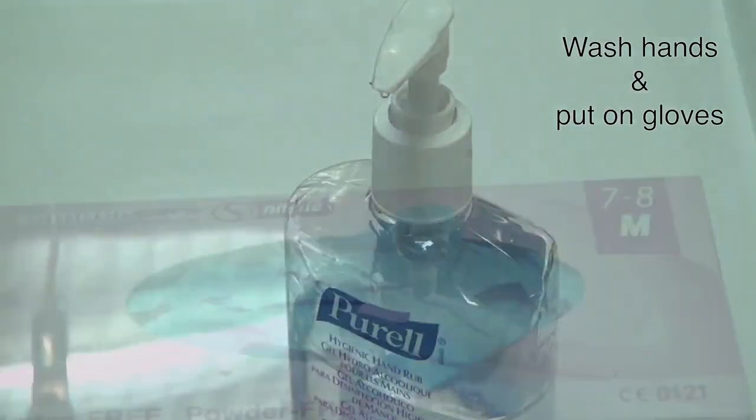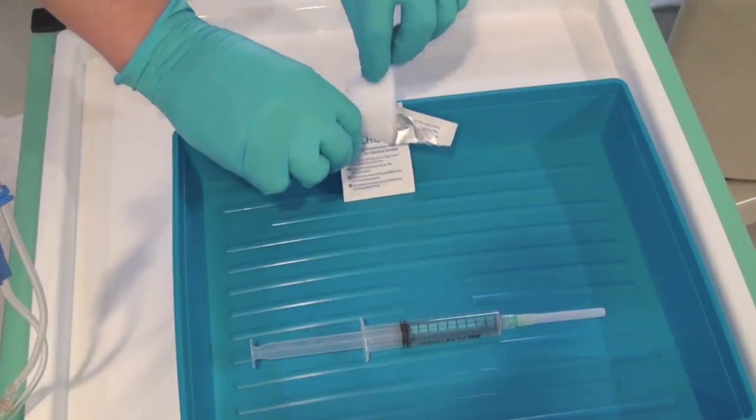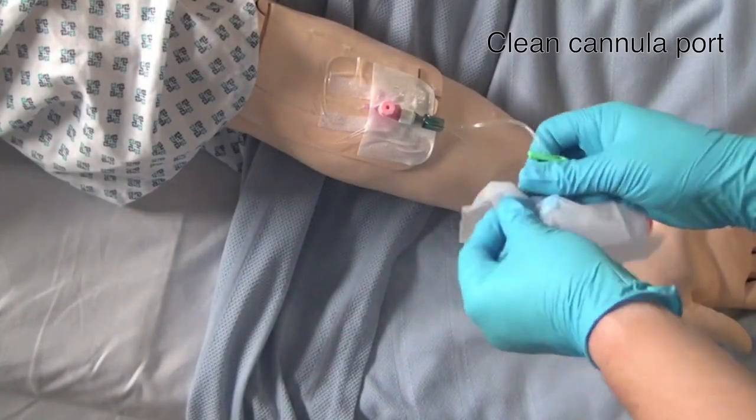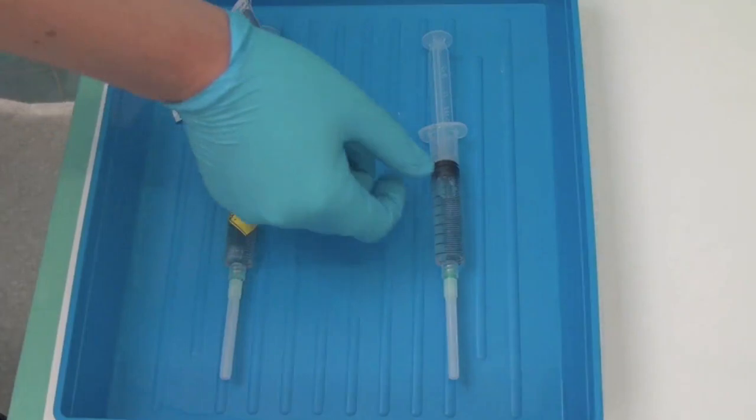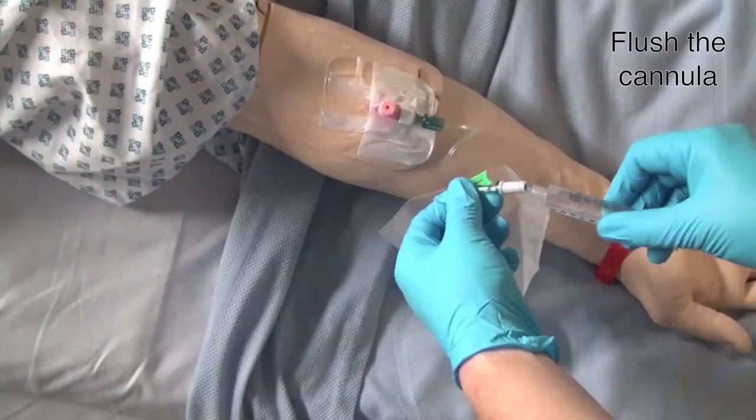Wash your hands and put on gloves. Clean the port of the cannula for 30 seconds. Flush a few mls of saline through the port to check the patency of the cannula.